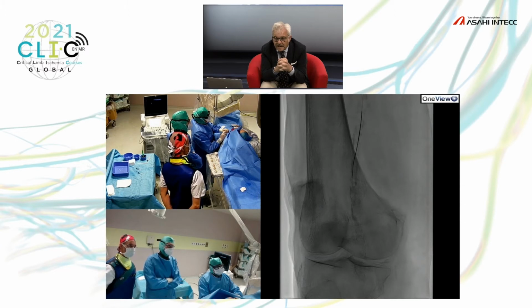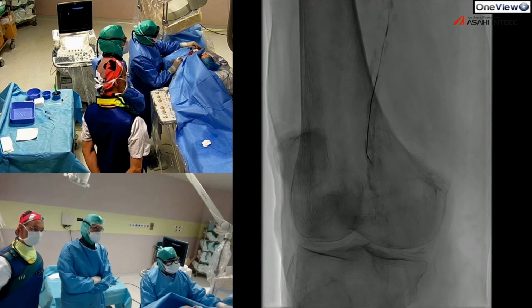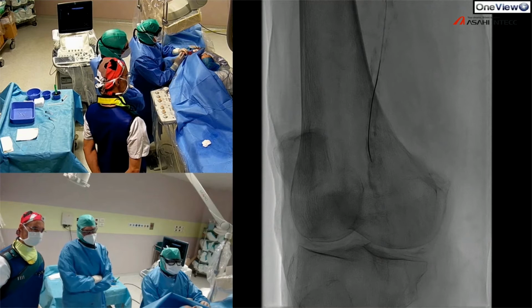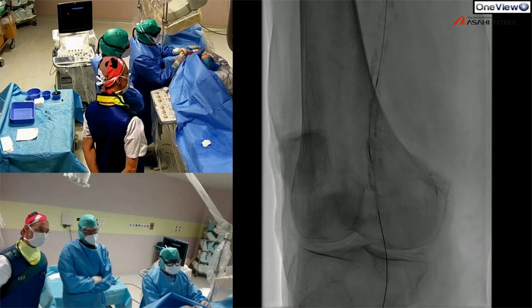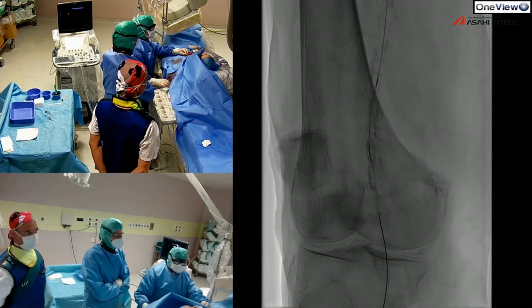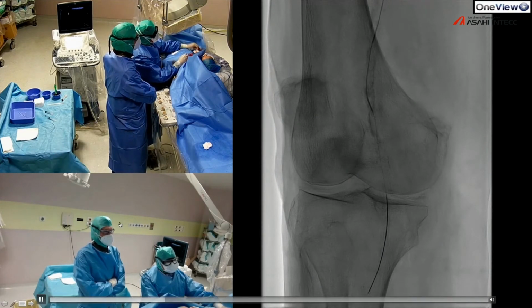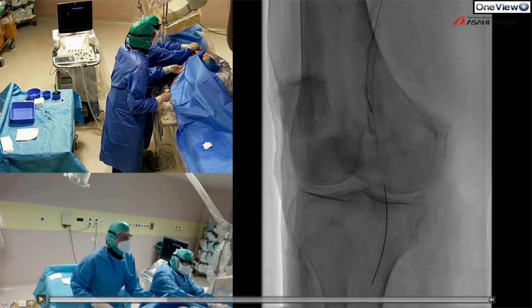this first microcatheter is the new Surgent support catheter from iVascular. But the optimal technique should be to keep and maintain the tip of the microcatheter, or the support catheter, very, very close to the tip of the wire. Right? In this moment, probably the wire succeeded in re-entering in the distality of the artery. I can stop a little bit.